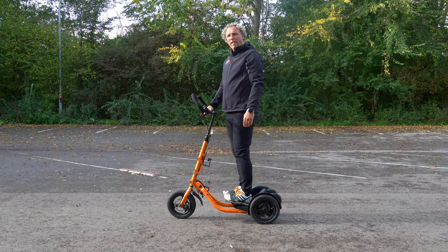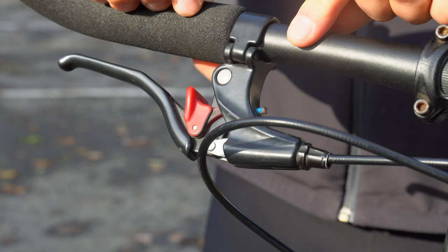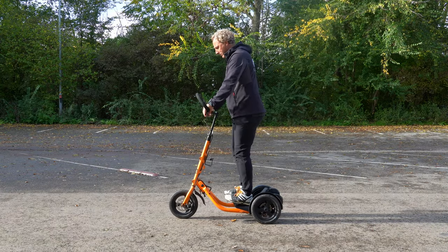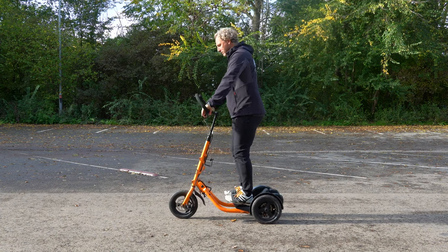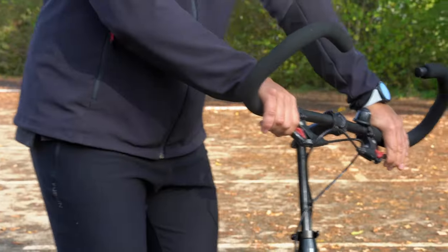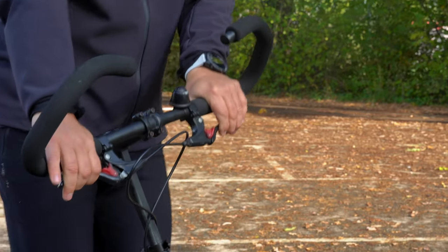Now that you are standing on the MiMover with the steering correctly adjusted and the brakes still engaged, you want to get familiar with the balance. Go from side to side until you feel comfortable in a still position. Once you feel comfortable, it's time to ride using one pedal.